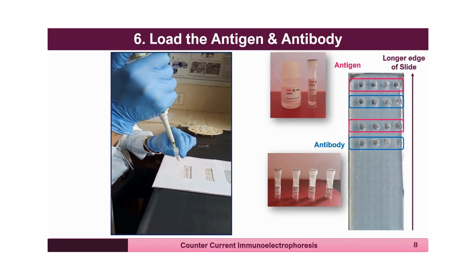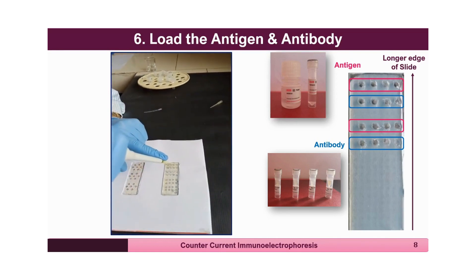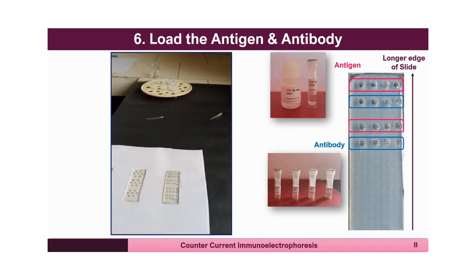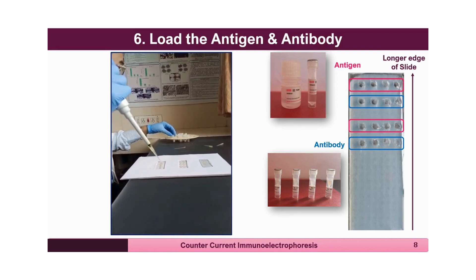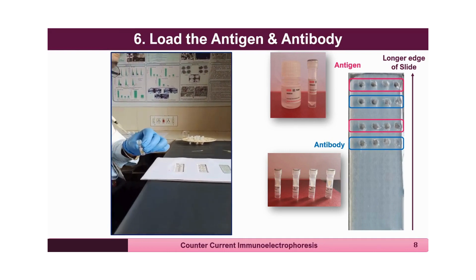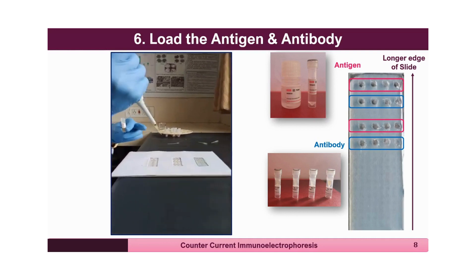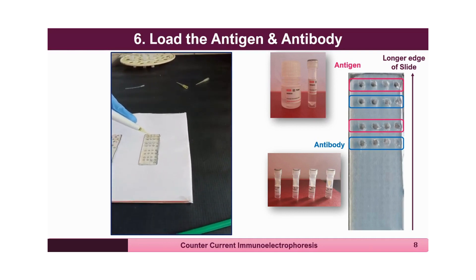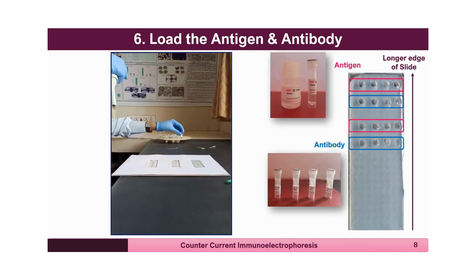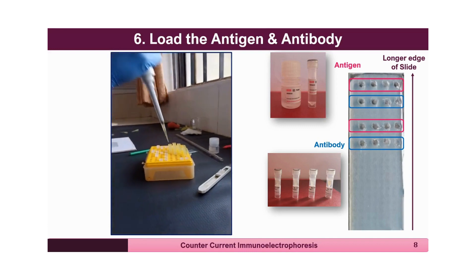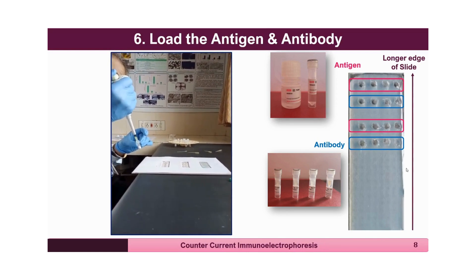In unknown samples, if the antigen is not present there will be no precipitin band formed. But in the control well, because you have loaded known antigen and antibody, a precipitin band must appear between the wells, indicating that the electrophoresis has run properly. Otherwise, if all samples are negative for the antigen and no control is loaded, the entire slide will show no precipitin band, causing confusion about whether electrophoresis took place. To avoid this, always load a known antigen and known antibody in the dedicated control well.